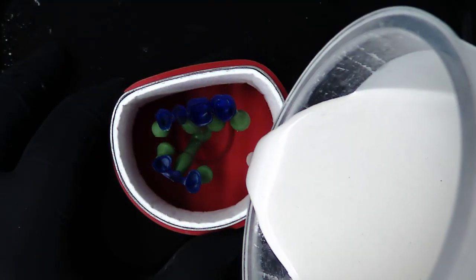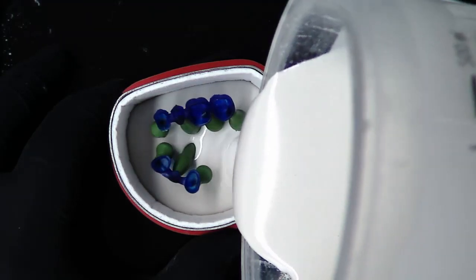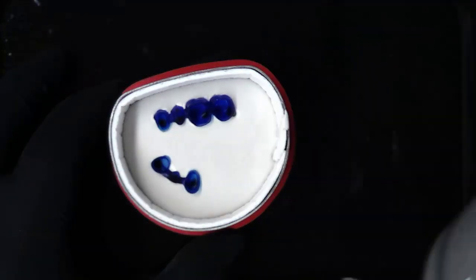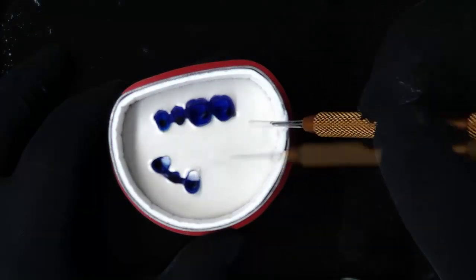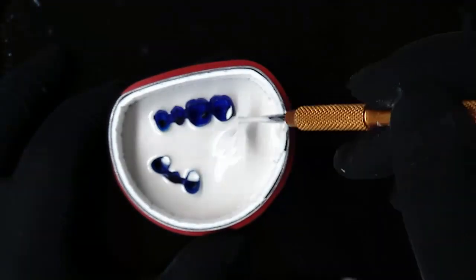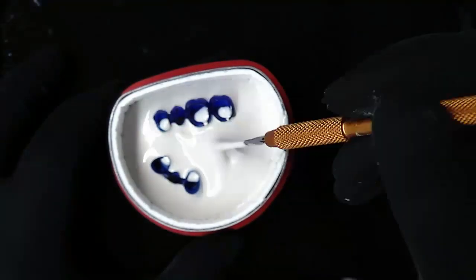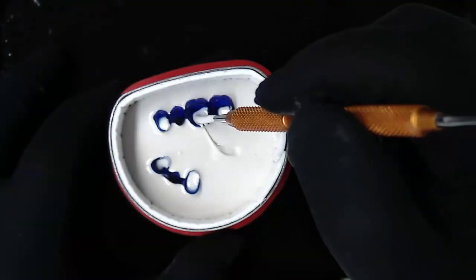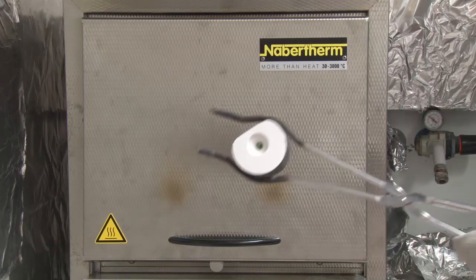The muffle former was extended by a muffle ring and muffle fleece. The fleece, shown here in white, is responsible for compensating the expansion of the investment material. When investing, it is important to carefully insert small amounts into the restoration with an instrument in order to prevent bubbles from forming in the edges of the restorations, which can later be found as metal spheres in the restoration, and are difficult to remove.